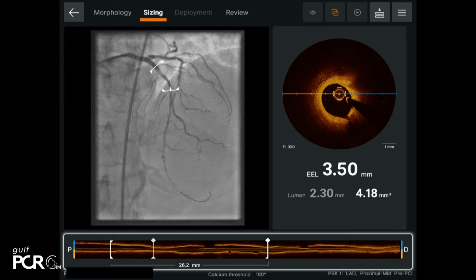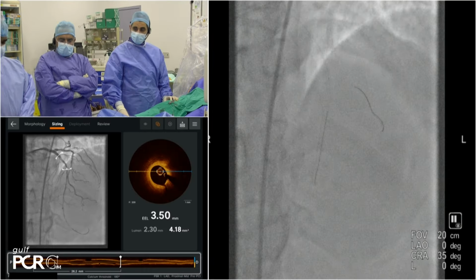So in this case, we plan to use orbital atherectomy because of the points Dr. Khalid mentioned: rota can be biased away from the nodule, as opposed to orbital atherectomy, which is going to orbit around the vessel lumen and hopefully shave it off. The mechanism is different. The rota works by frontal cutting, as opposed to the orbital, which orbits around and shaves around the calcium. So we'll do that, then we'll use a cutting balloon, and then we'll post-dilate with NC and see how things go.